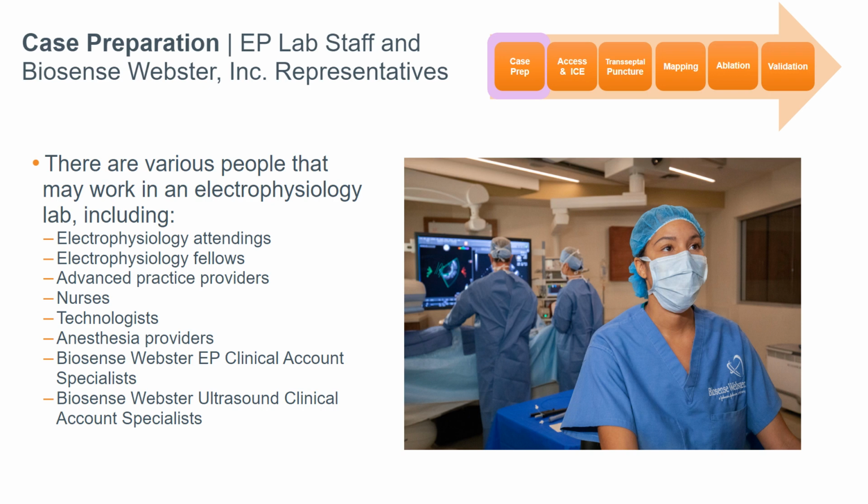They may prepare the patient table and hand off equipment to the sterile team during the procedure. In some EP labs, nurses and technologists also assist with vascular access and running the pacing systems. Technologists may also manipulate the fluoroscopy equipment. Each hospital and state has unique responsibilities assigned to each member of the lab staff.